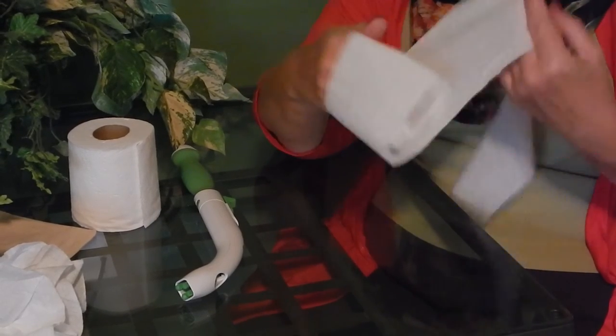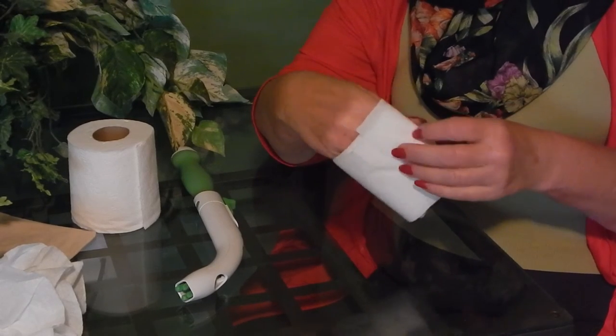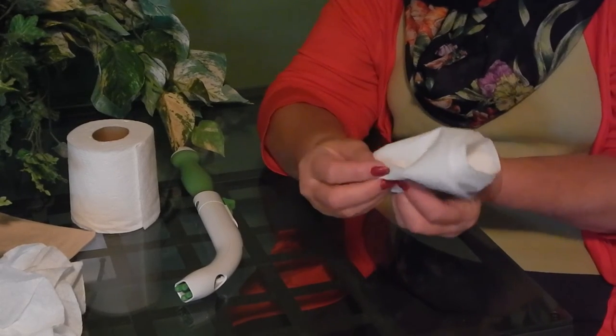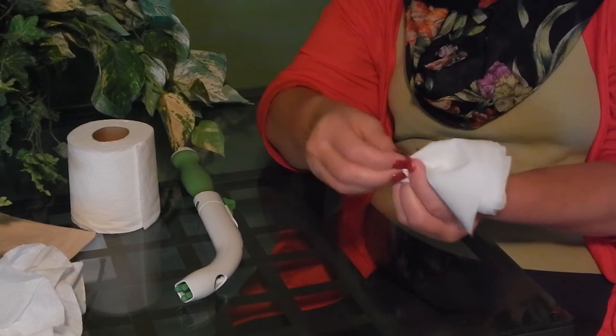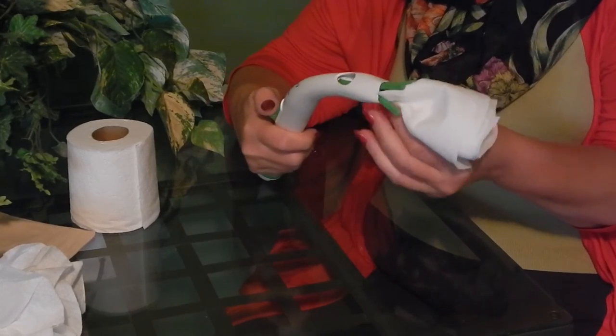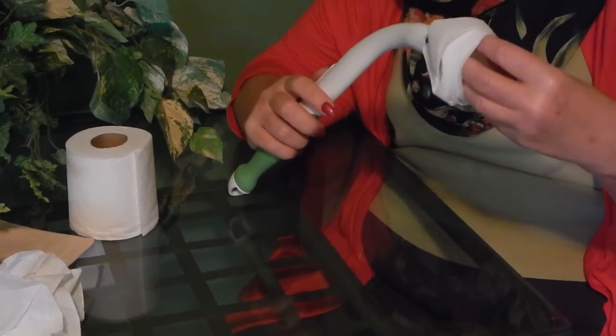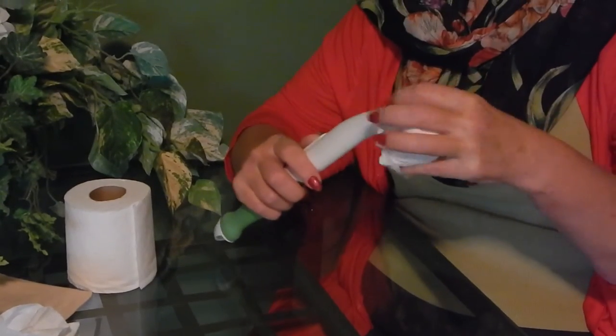When you get that tube done, you take one end of the tube and you pinch it together. That's the whole key to loading the Freedom Wand — having that point, putting it deep into the grippers, and you pull it in. Because you've just made an opening in your tube, you can now put your fingers in there and fold that tube backwards, and now you can wipe that way.